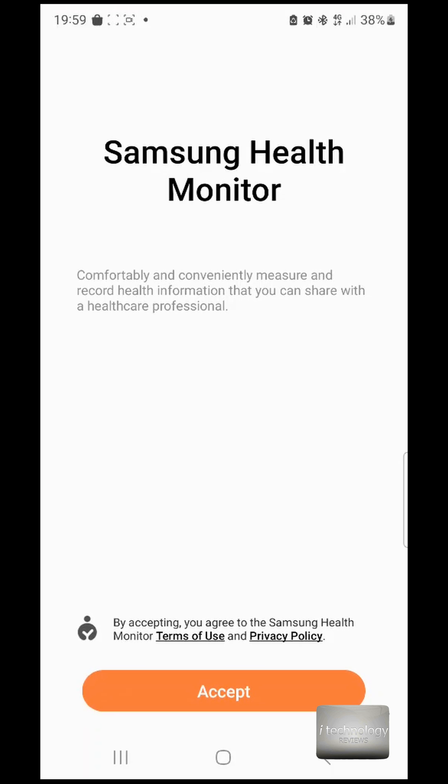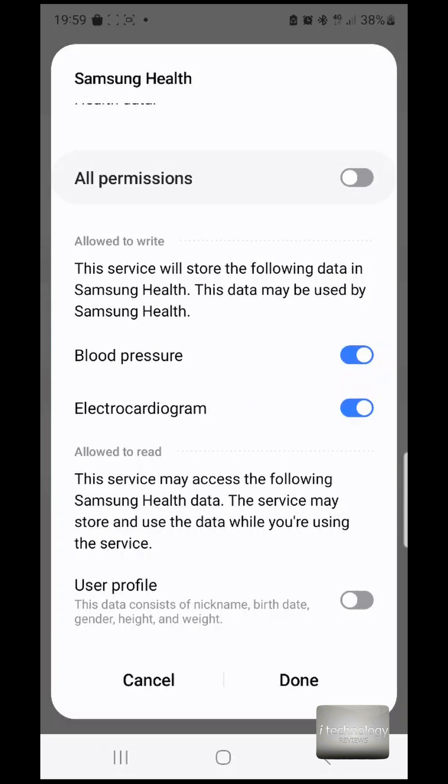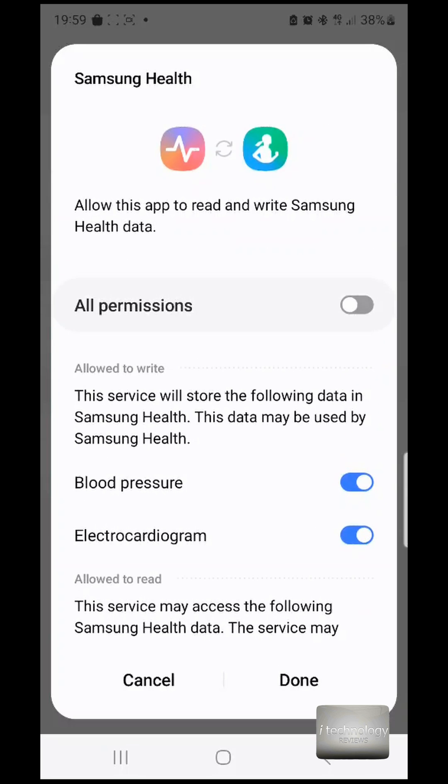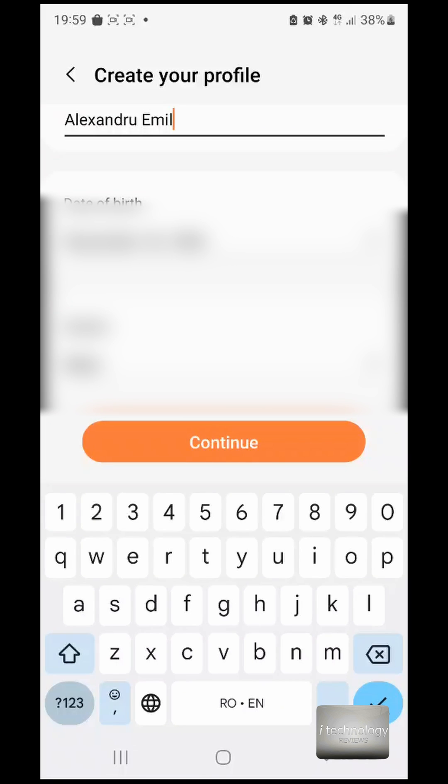Now let's open it. We have to set up the electrocardiogram — the ECG. Let's go through all the permissions — no problem — because it will store data into the Samsung Health profile.